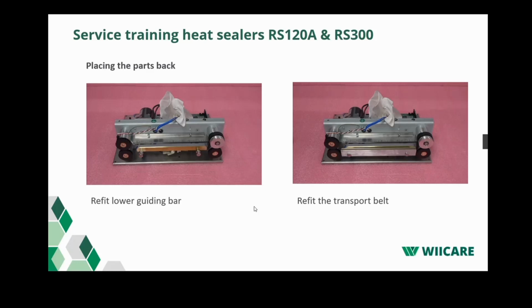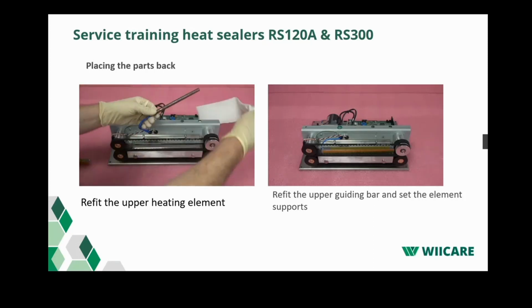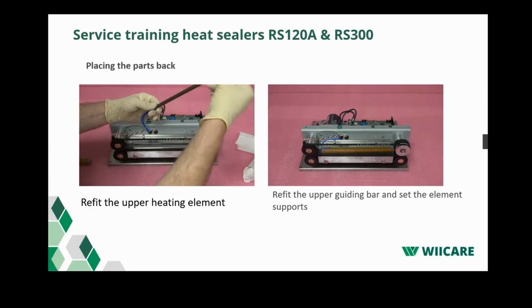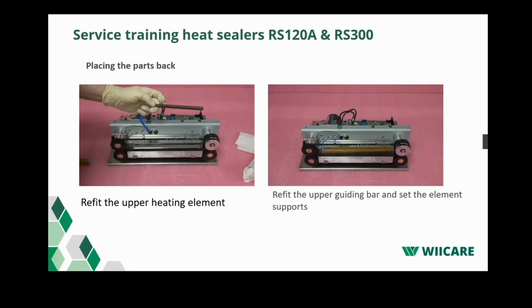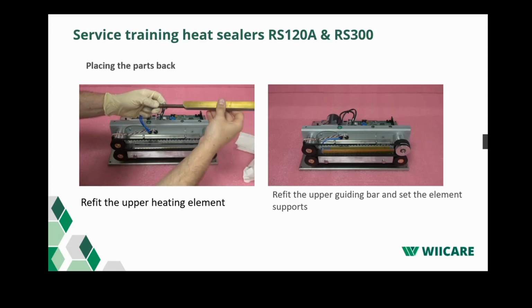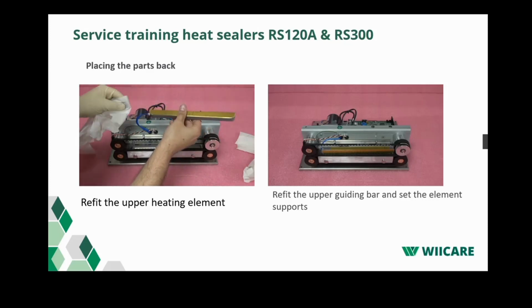Let's have a look. Let's go again. Pull the transport belts back on. Let's see. Here we go to the video to refit the upper heating element. Put the heating back in the bar. Make sure to put some copper paste on it. Wipe off any excess.